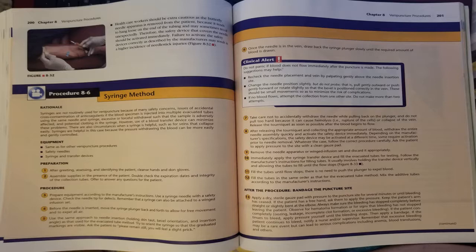Healthcare workers should be extra cautious as the butterfly needle apparatus is removed from the patient because it tends to hang loose on the end of the tubing and may sometimes recoil unexpectedly. Therefore, the safety device that covers the needle should be activated immediately. Failure to activate the safety devices correctly, as described by the manufacturers, may result in a higher incidence of needle stick injuries. Pages 200 and 201 show procedure 8.6, the syringe method.